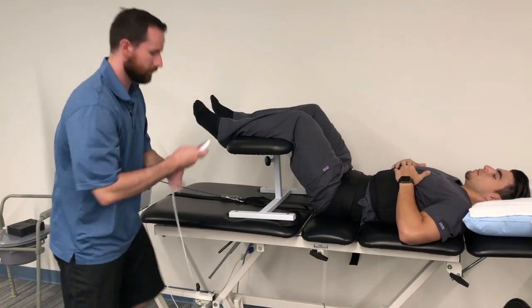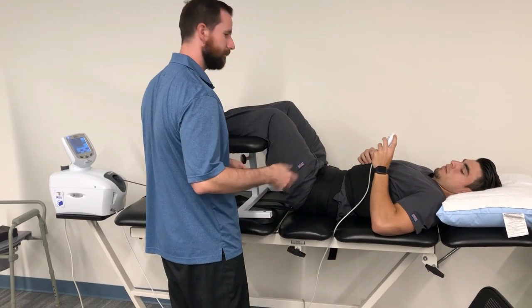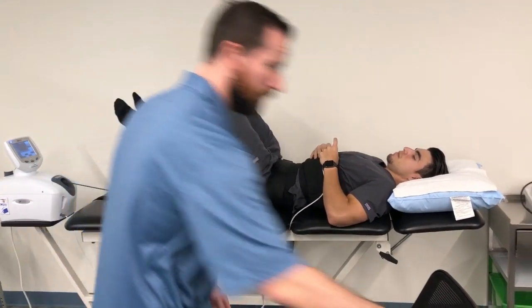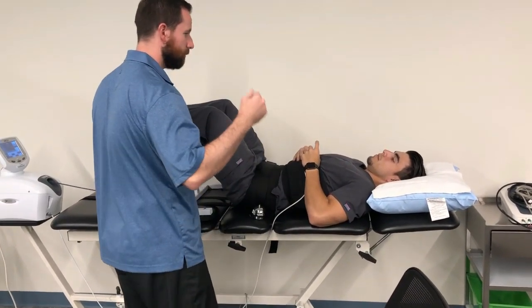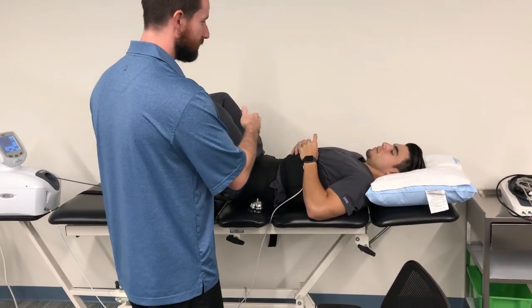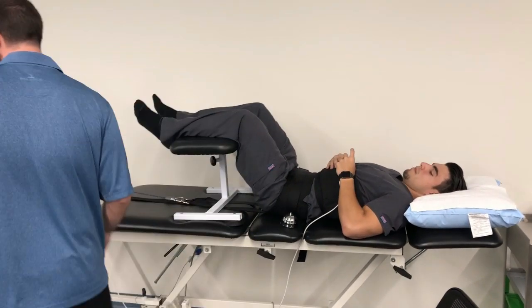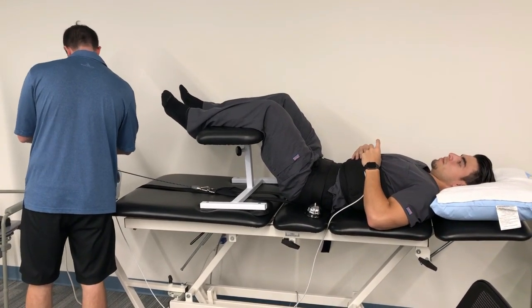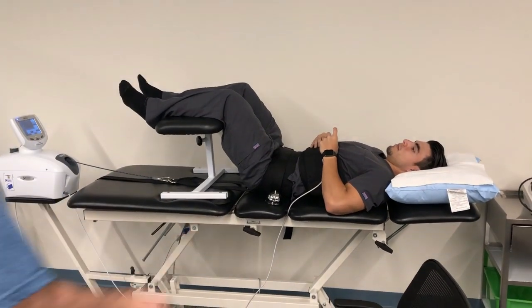I have this button right here, so if at any time during the treatment you start feeling pain or discomfort, you can just hit that and it will automatically stop and I will come over. I'm also going to give you a call bell because I'm going to be on the other side of the room, so you can hit that button to stop it and then ring the call bell, let me know what's going on. So I'm going to go ahead and start the treatment. And I'll wait 5 minutes and then come back.